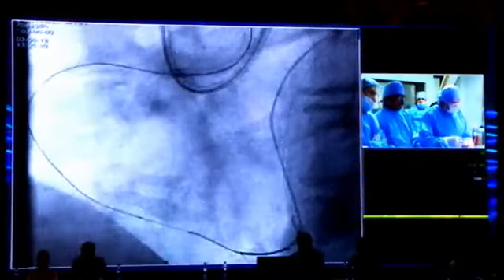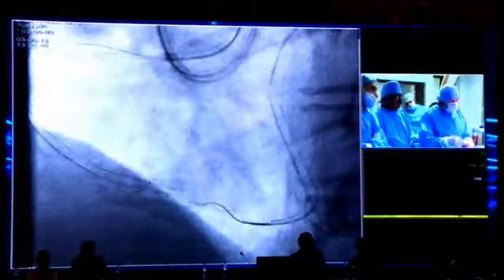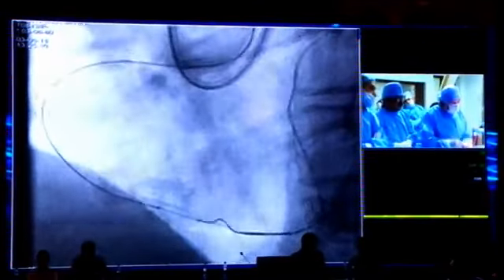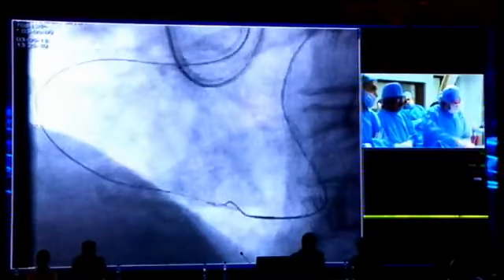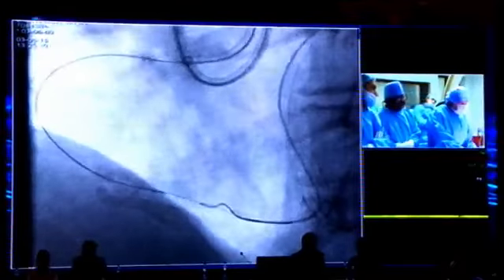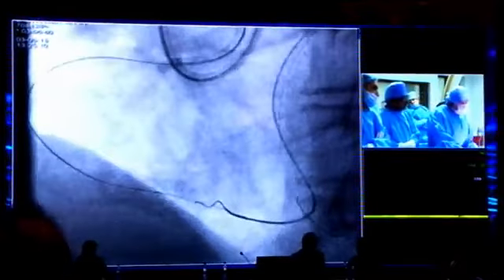Dr. Goel, what kind of wire would you prefer? We are thinking of this. The buckling of the wire, I feel, is not good. I have a feeling this buckling of the wire tells us that we are subintimal, and we need to improve the strength of that wire.